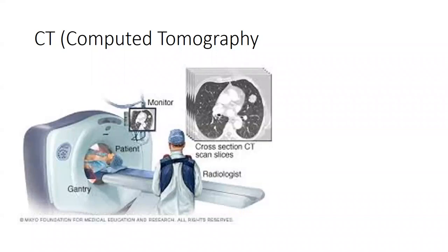All right, and CAT scan has the finest resolution of any study, especially for bone. So we can change the contrast so we can see certain structures better. There are windows for air-filled structures, windows for blood-filled structures. We can add contrast if we want to. You know, abdominal CAT scans, pelvic CAT scans, they'll add oral contrast or rectal contrast. And you can add IV contrast as well, so you can see everything light up and see the relative positions of everything.